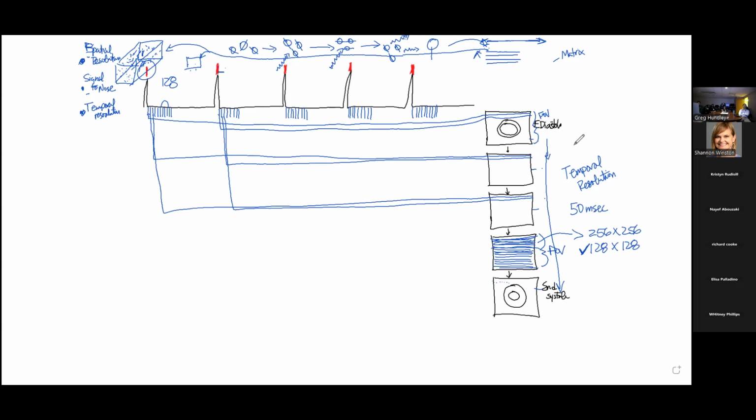So Shelley, you're here in the room, one of our technologists. And if we want to make one of those cine movies, we were showing earlier a short axis, how long does it take us to make, just acquire the images for one of those? About 10 seconds. 10 seconds. All right, so what's going on so that you get that cine movie?